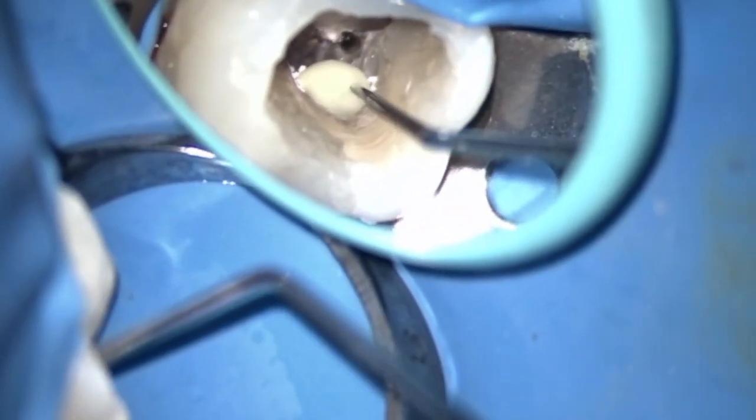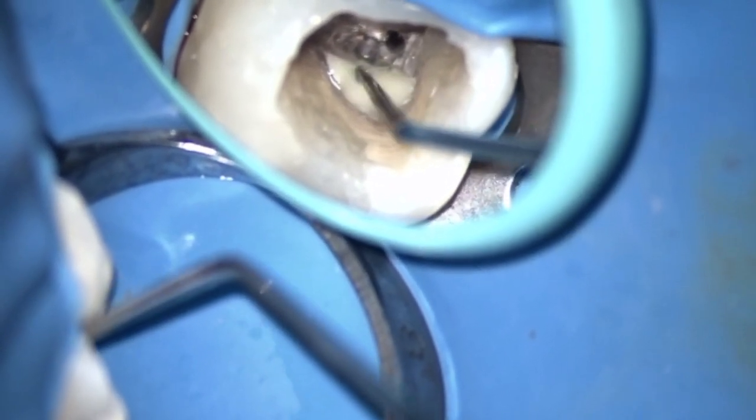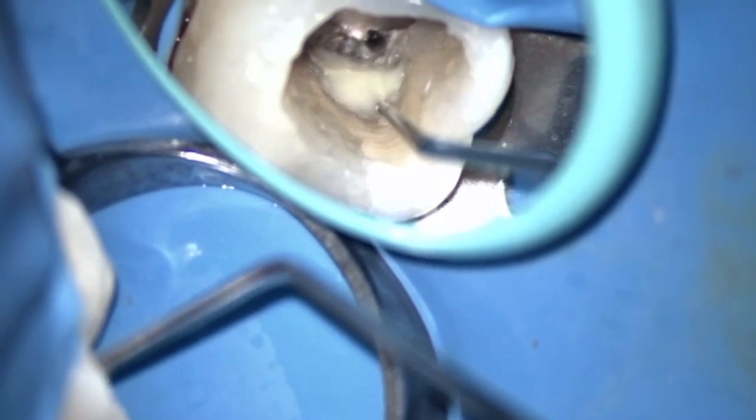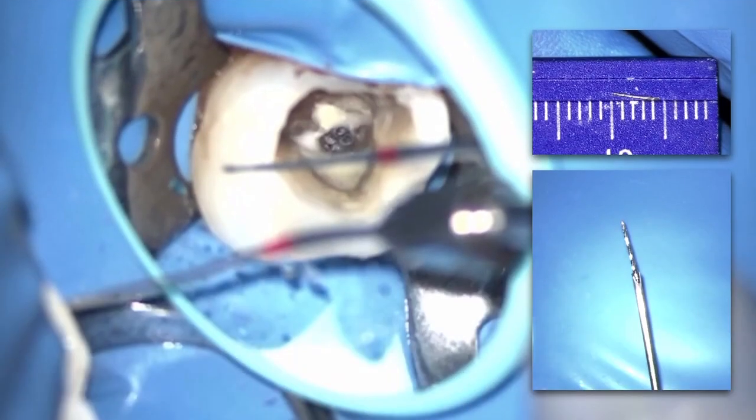So I can say that it is possible even with the loupes, but absolutely with the dental operating microscope, it is amazing, because with the dental operating microscope you are able to deal with 20 microns, but with the loupes, not. So this tells us how easy it is to control such complications that happen.